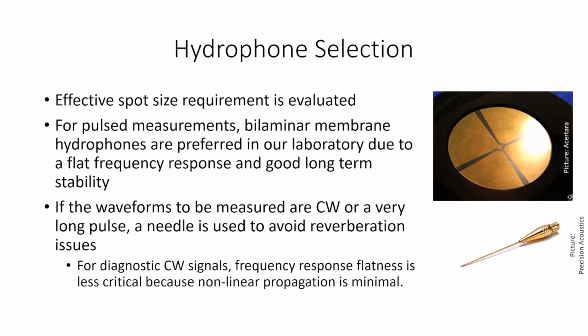It is worth pointing out that some of the more advanced systems and super high resolution systems actually are capable of producing focused beam areas that are small enough such that pretty much all hydrophone technology is at least a little bit challenged in making those measurements.